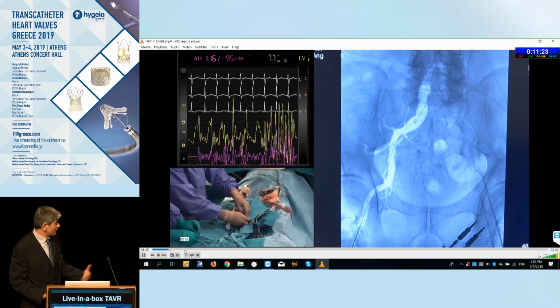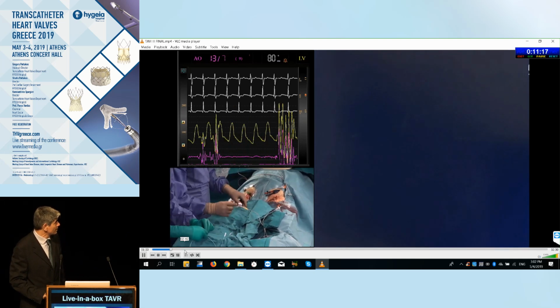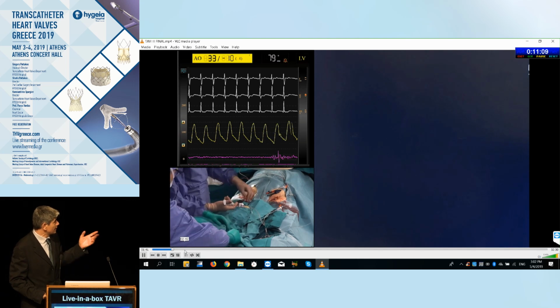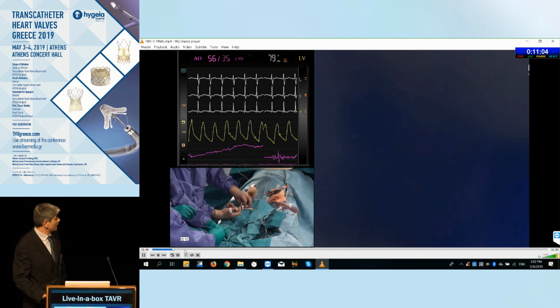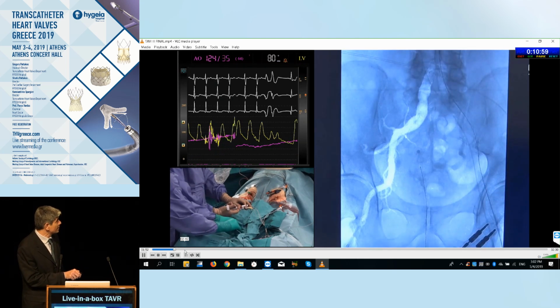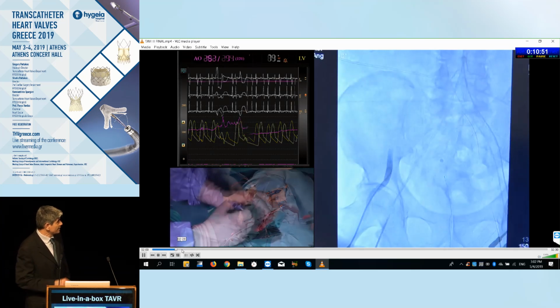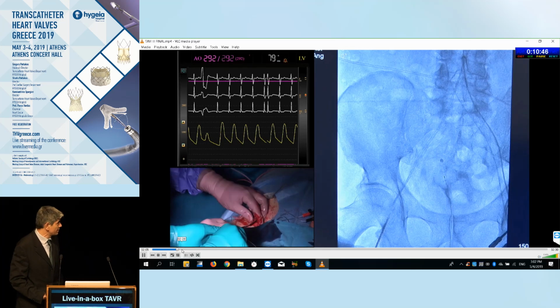Nowadays, we have switched to try to go more with echocardiographic guidance for these punctures. Here we see the initial angiogram for the access site, making sure everything is okay. We already have a 7 French venous sheath on the left side, and the 7 French arterial sheath on the left side as well. And we see that the implant site and the puncture were very appropriate.